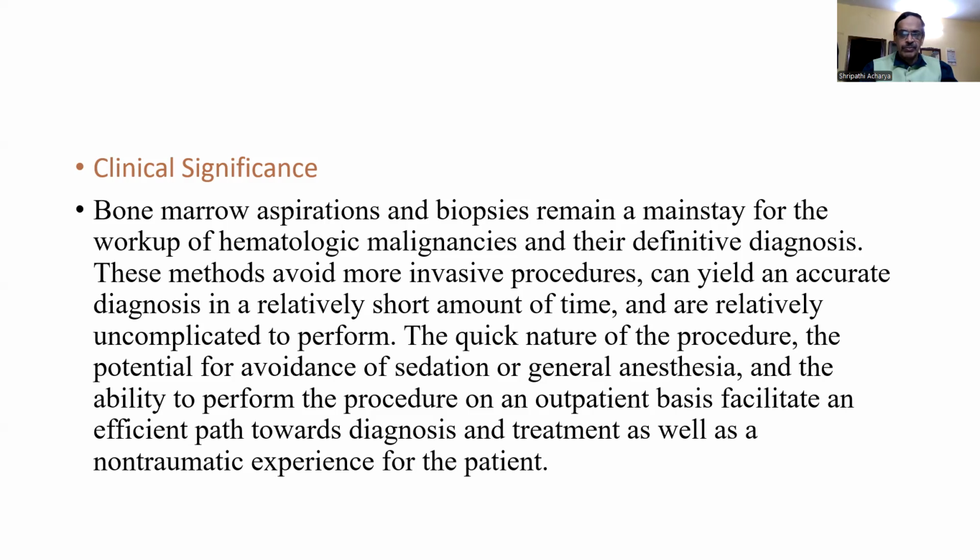The quick nature of the procedure, the potential for avoidance of sedation or general anesthesia, and the ability to perform the procedure on an outpatient basis facilitate an efficient path towards diagnosis and treatment, as well as a non traumatic experience for the patient.